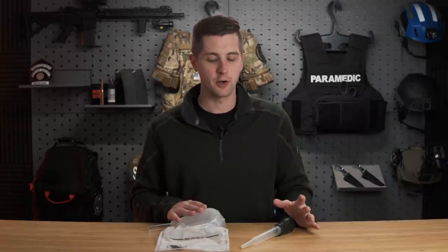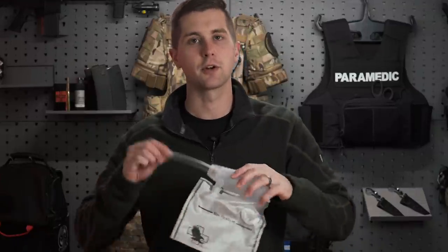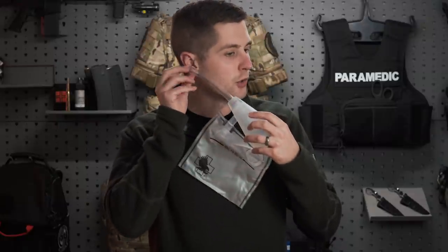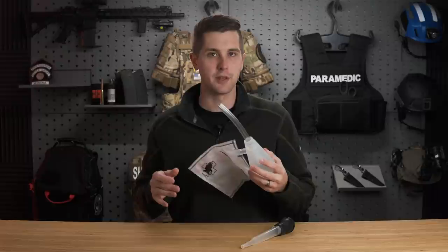The second rule is that we want to measure. Similar to an oropharyngeal airway, we want to take the suction catheter and measure it from the ear to the corner of the mouth, and we don't want to go deeper than that.